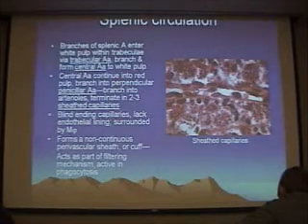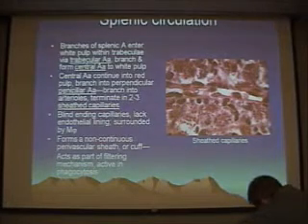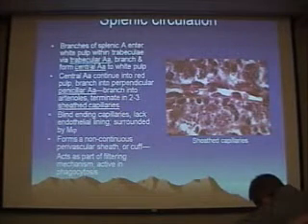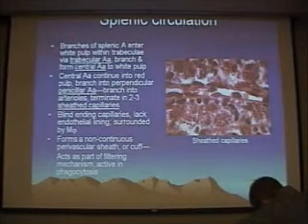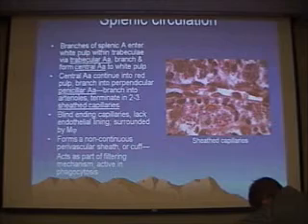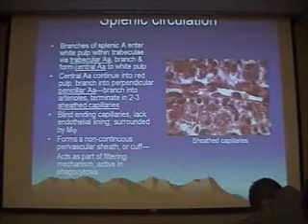Within the spleen, remember, one of the spleen's main jobs is filtration of the blood. How is it filtering the blood? Well, the answer is it has these very specialized capillaries called sheath capillaries. And these sheath capillaries are surrounded by macrophages. And so here's a layer of this macrophage cuff or sheath surrounding these capillaries.